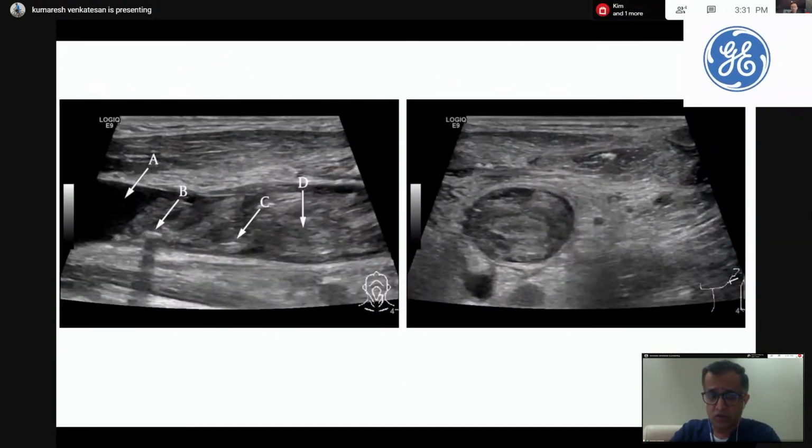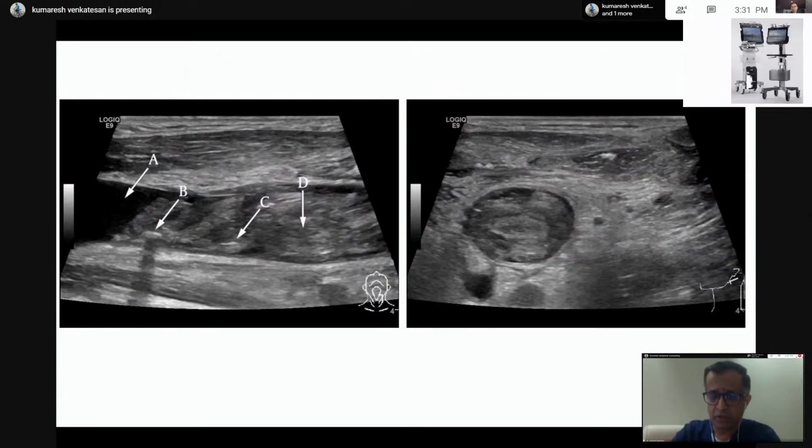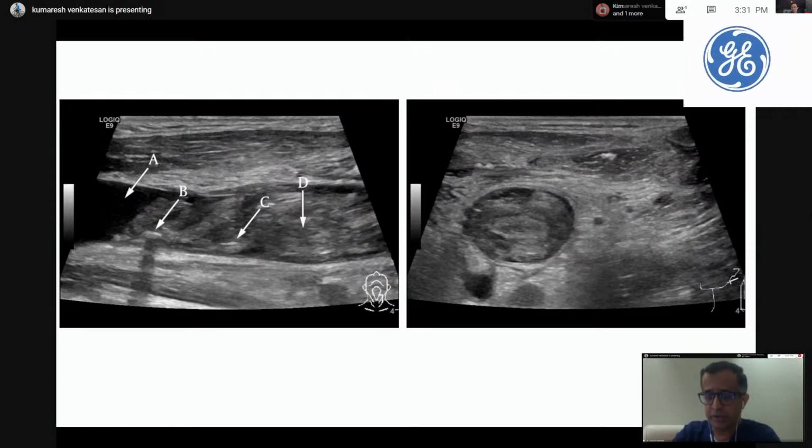The other use of looking at the vessel is to see whether there are any big clots present. In this patient, you can see the clot almost filling the whole of the internal jugular vein. If you find this, you will have to look for another vein, another site to perform the cannulation. Again, this is why it's important to do the stepwise approach, so that you know which vessel you're going to go for.